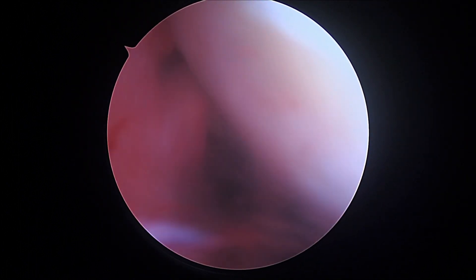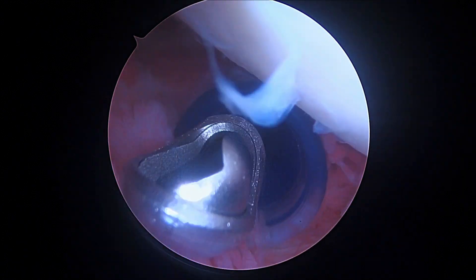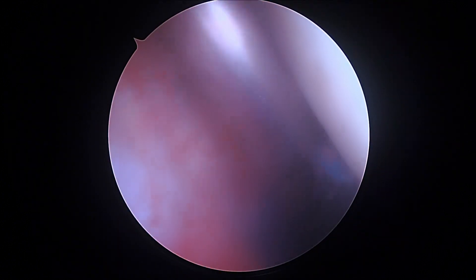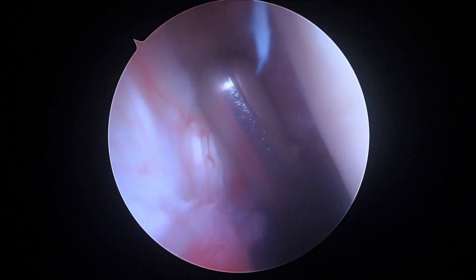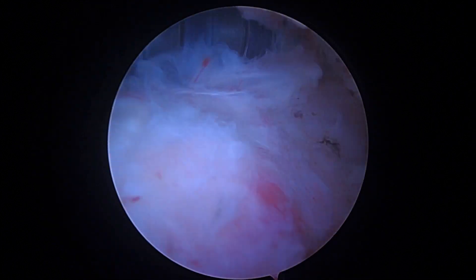Okay, so here's where the recurrent tear is, right at the top of the screen here. You can see it's very vascular. We're going to stop inside the joint and switch positions with your shoulder in just a minute. We'll be able to find this area pretty quickly once we change positions.